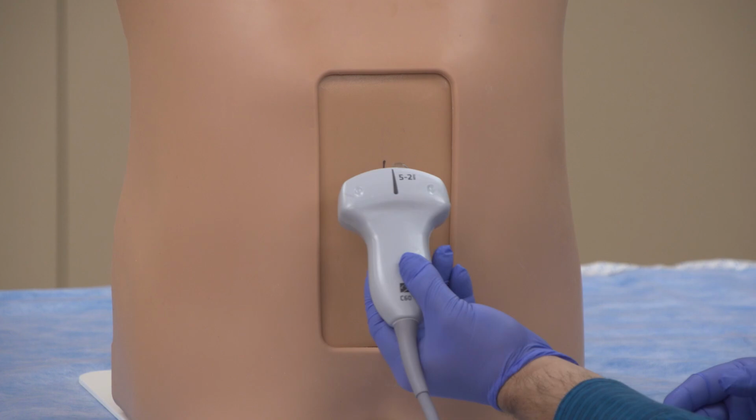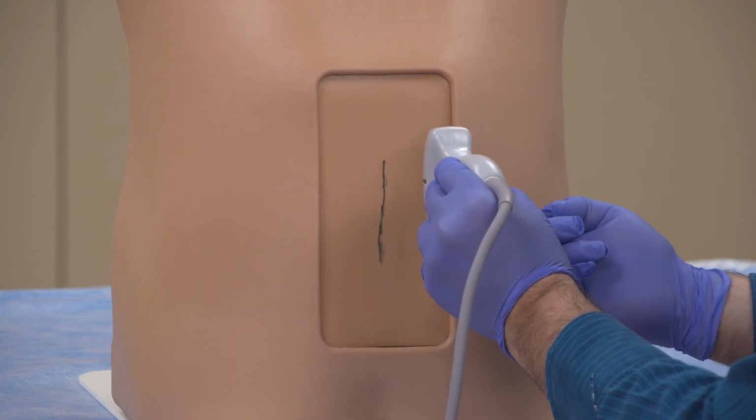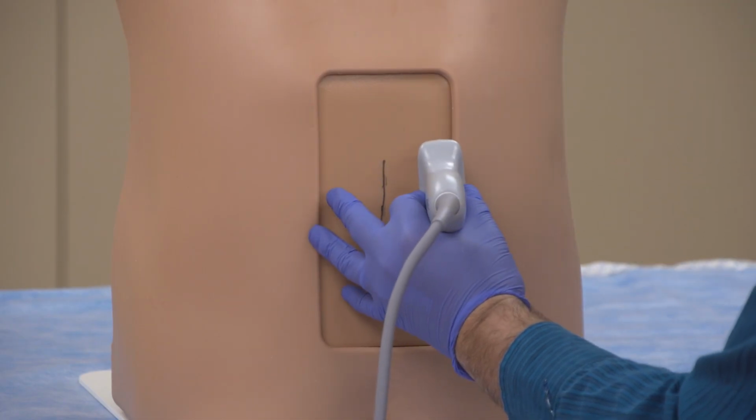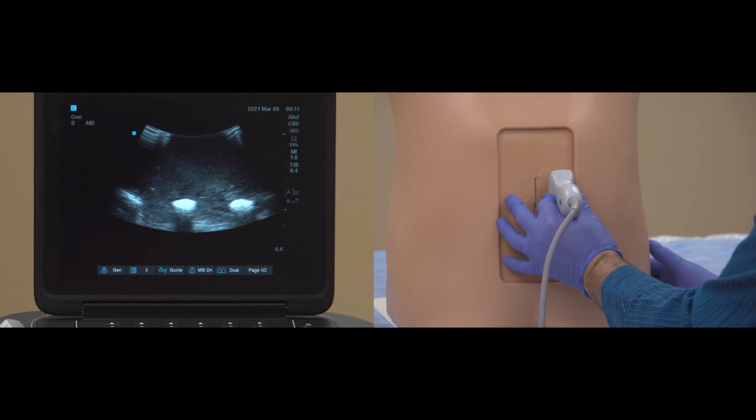Rotate the transducer 90 degrees. Note that we prefer rotating the probe to be oriented caudally so that the right side of the screen corresponds to superior spinal levels. Place the probe lateral to the marked line. First, you will see the trident sign, the distinct projections of the transverse processes. They appear separated and deep.